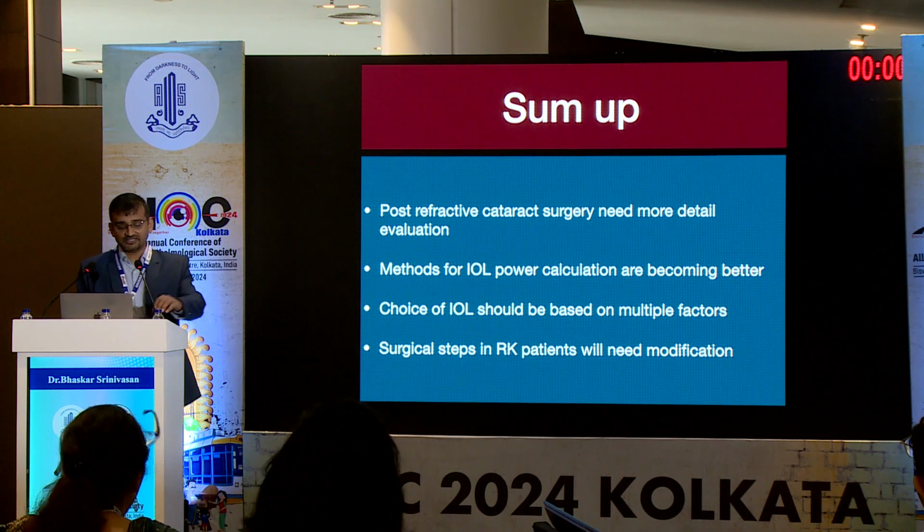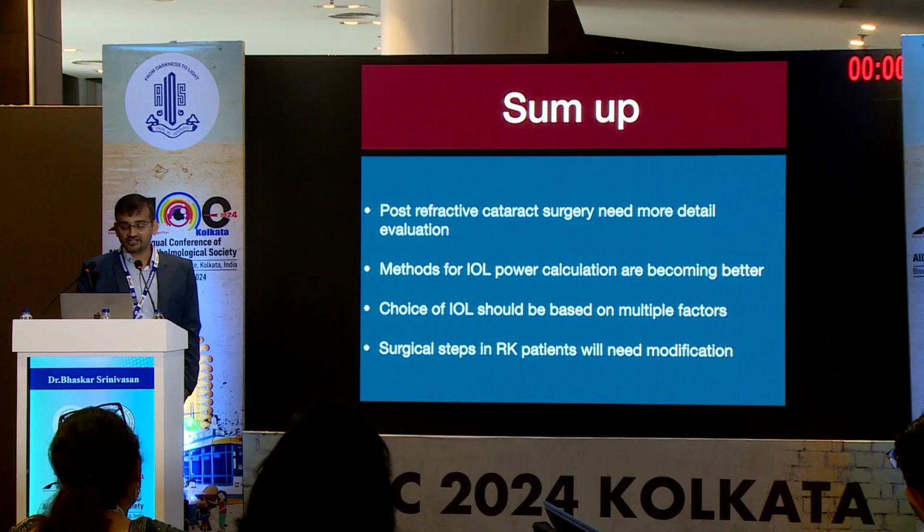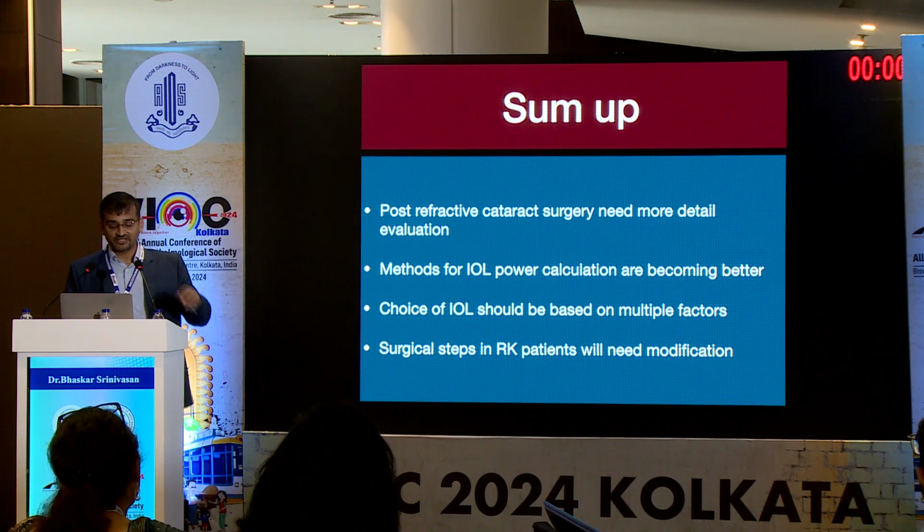So I would sum up by saying that post-refractive cataract surgery needs more detailed evaluation. Methods for IOL power calculation are becoming better. Definitely, we are able to predict better now. Choice of IOL would depend on multiple factors, and surgical steps in RK will need modification. Thank you so much.